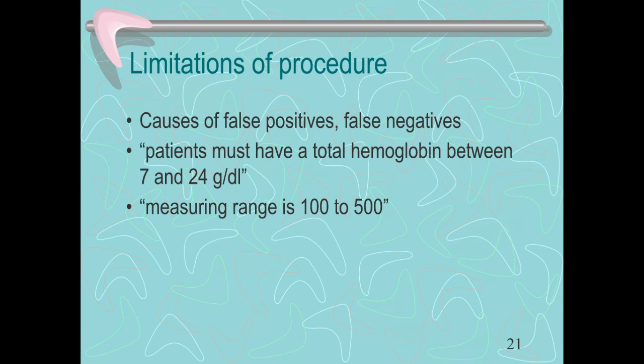Finger stick blood sugars, if it's going to be over 500, lots of times it's just going to say high. So be aware that if it reads an alternative or it doesn't give you a number, then you're going to need to retest and then report that to the physician immediately.